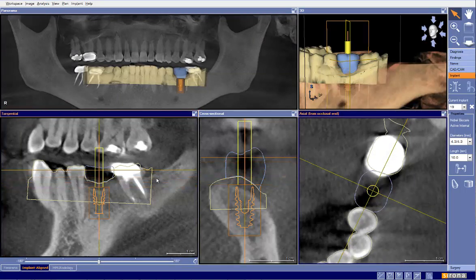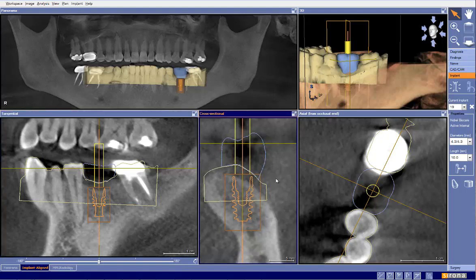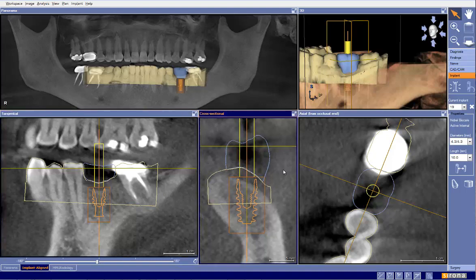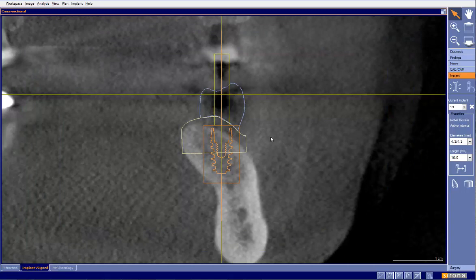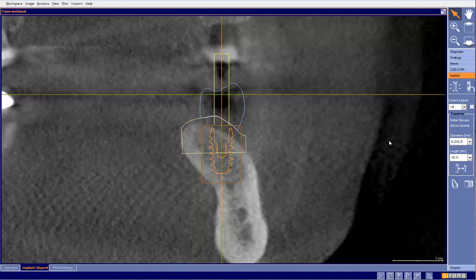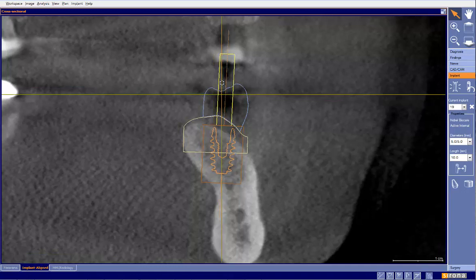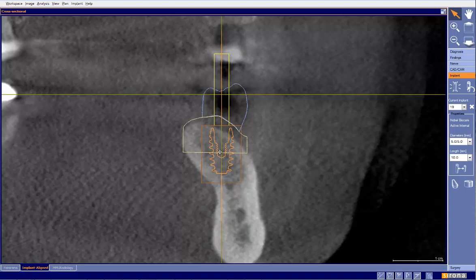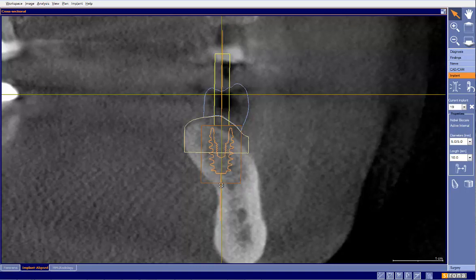Now let's focus on the implant plan. Mesiodistally it looks great, buccal-lingually looks pretty good. The occlusal table looks very nice coming right through the center of the tooth, and our occlusal plane looks quite nice — everything is done pretty well here. My only concern is in this cross-sectional view: I think we're too far to the buccal. I would also like to go with the 5.0 implant, especially if we can do the 10mm. If we're going to graft those buccal threads anyway, it doesn't really matter whether we do a 4.3 or 5.0. I would also tilt this back a little bit — we're a little buccal to our central groove — which would give me more distance to the buccal and get me in the center of the tooth, then cheat the apex slightly like this.